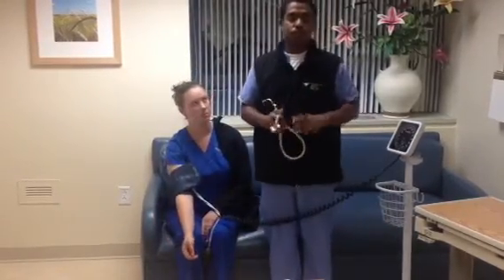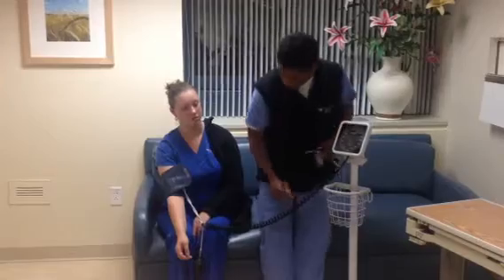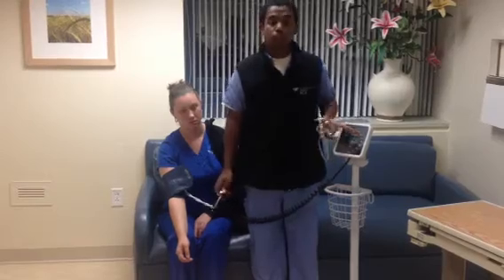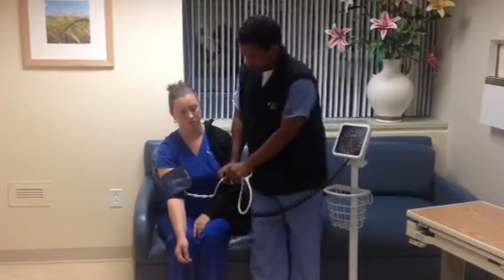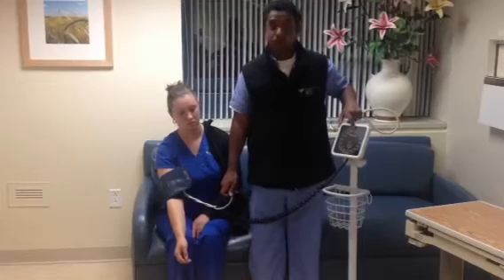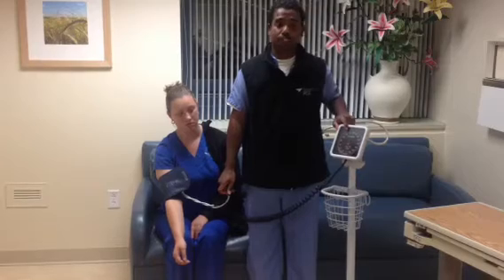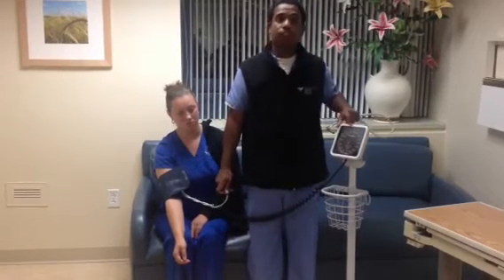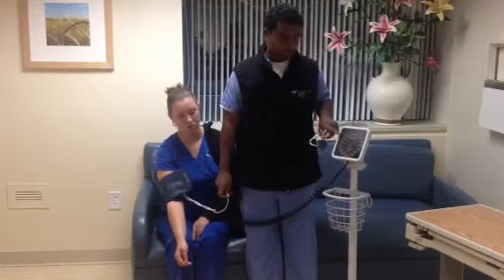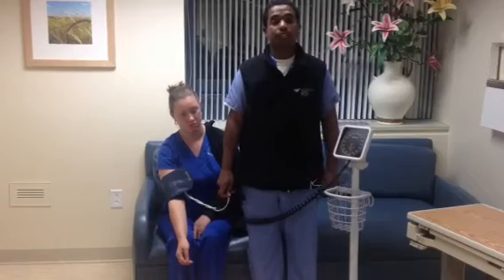Before I perform this procedure, I need to explain the sphygmomanometer. The sphygmomanometer has this bulb which I will be inflating. As I inflate, I will be going up to about 200. When I reach 200, I will be deflating it slowly using this knob. This knob will decrease the numbers until I hear the first thud. That first thud will give me her systolic reading. After getting her systolic reading, I will continue to hear little thuds. Usually around 80, I should be hearing a faint thud, and once I hear that very last thud, that will give me her diastolic reading.